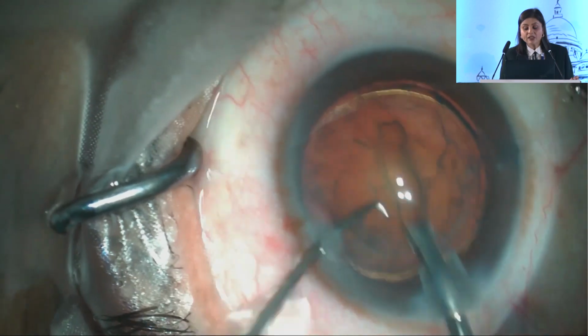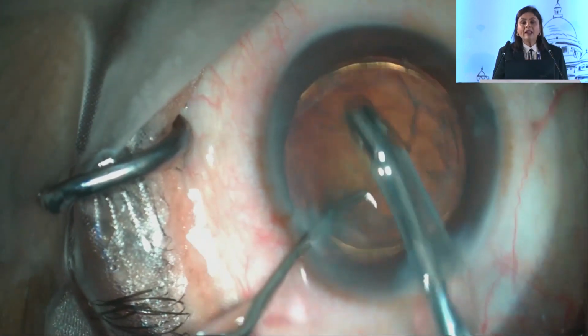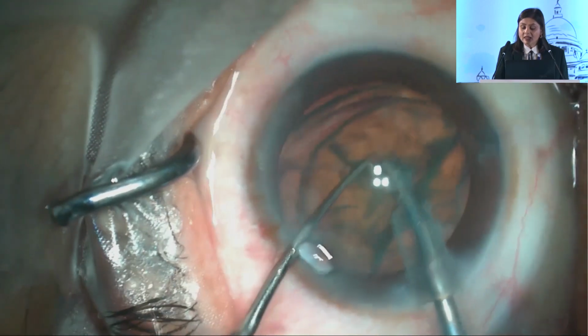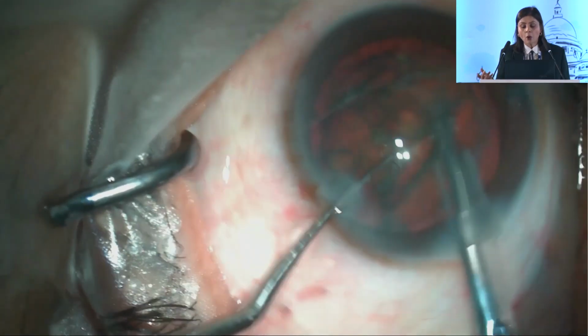And then the trench that we need to make here is not very wide. We need to make a narrower and shallower trench than we would make in hard cataracts. And then we can easily crack this into two heminuclei and proceed safely with stop and chop.